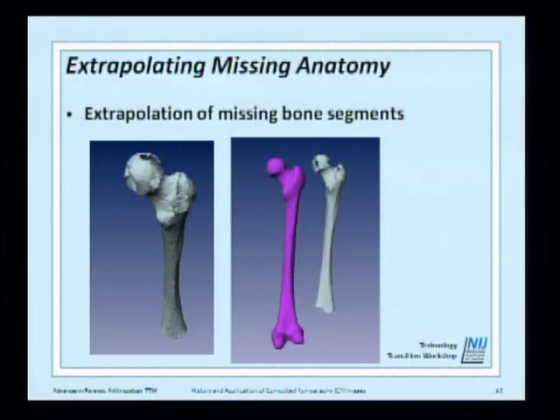You can look at the bone as one bone, or divide it into multiple areas, and then have multiple statistical atlases on different parts of the bone, like distal and proximal. The pelvis, for example, is divided into a number of areas. Same for crania. That's how we give weight.